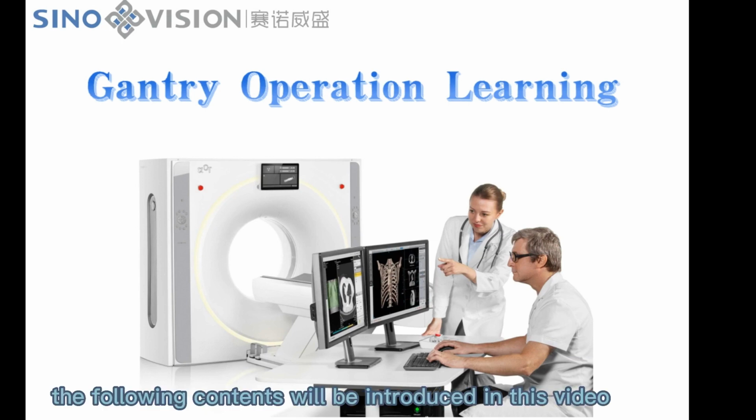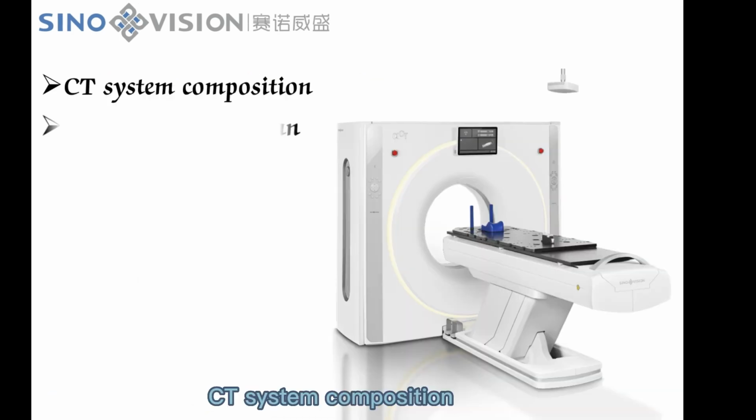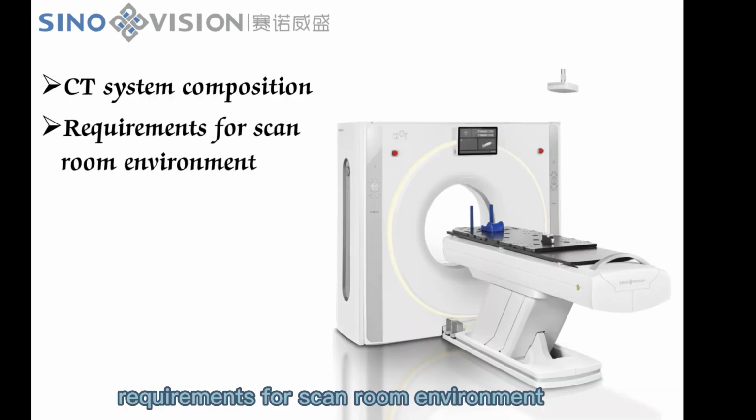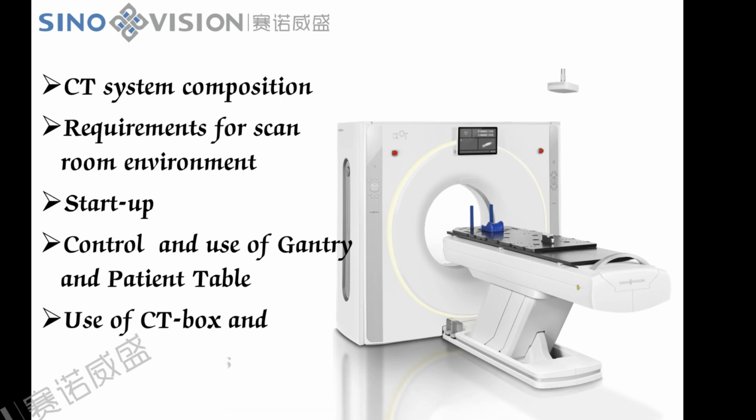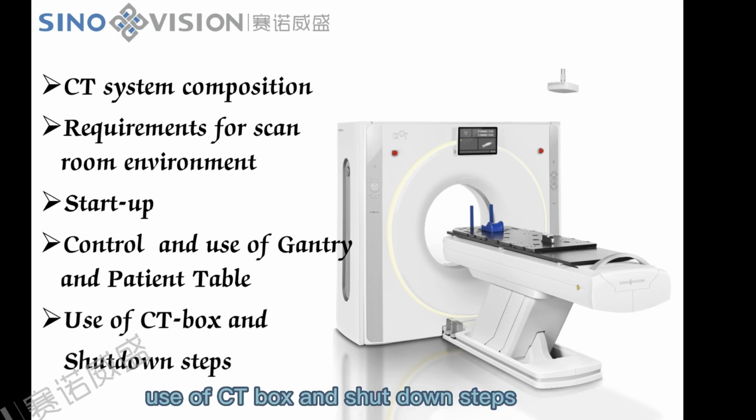The following contents will be introduced in this video. CT system composition. Requirements for scan room environment. Startup. Control and use of gantry and patient table. Use of CT box and shutdown steps.